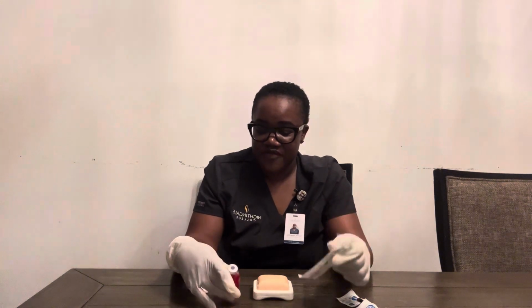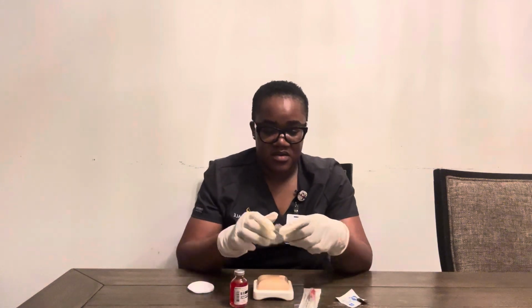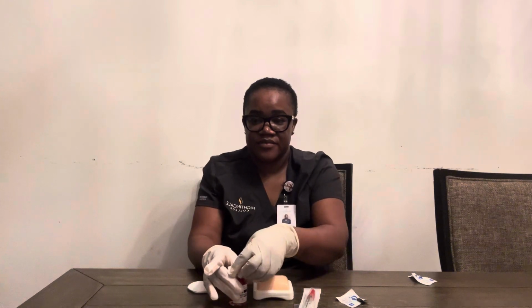All right, so the next thing that I'm going to do, I'm going to verify that I have the right syringe for this application. And what I have is a 1 milliliter tuberculin syringe with an attached 25 gauge 5/8 inch needle. And I'm also going to verify that I have my tuberculin vial. And then I'm going to clean the top of my vial using my alcohol prep pad.